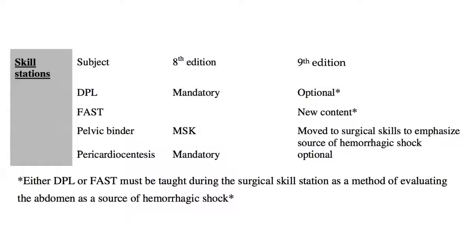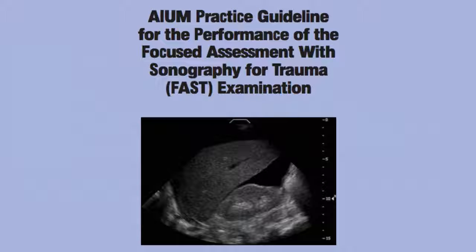And as you can see, even ATLS has caught up, where the DPL is no longer mandatory but optional, and the FAST can be used as a replacement skill station. Now, there are practice guidelines for the performance of the FAST, and this is a guideline provided by the American Institute of Ultrasound in Medicine in cooperation with the American College of Emergency Physicians.